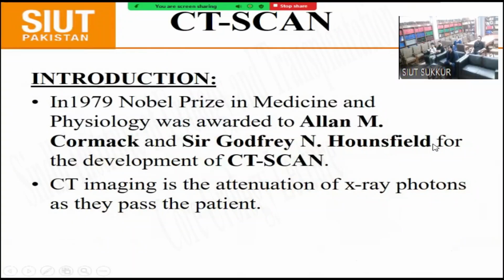So starting with the introduction of CT scan. In 1979, the Nobel Prize in Medicine and Physiology was awarded to Allan M. Cormack and Sir Godfrey Hounsfield for the development of CT scan. CT scan imaging is the attenuation of X-ray photons as they pass through the patient's body.